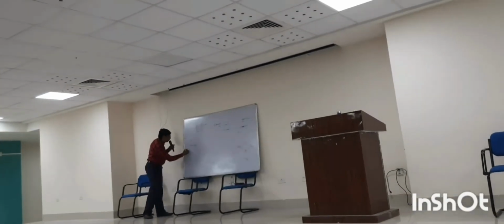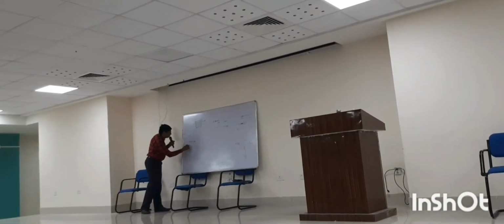Now the paper speed is 25 millimeter per second. So 1500 millimeter per minute.